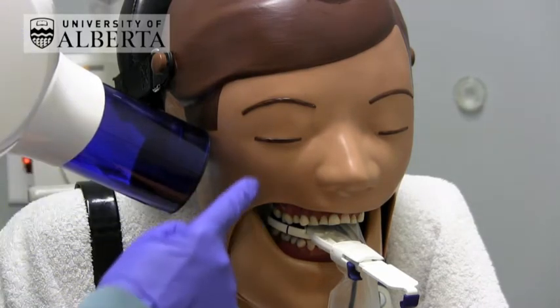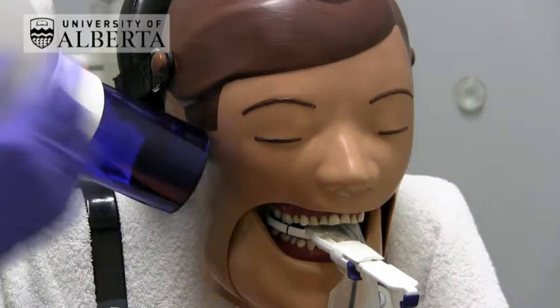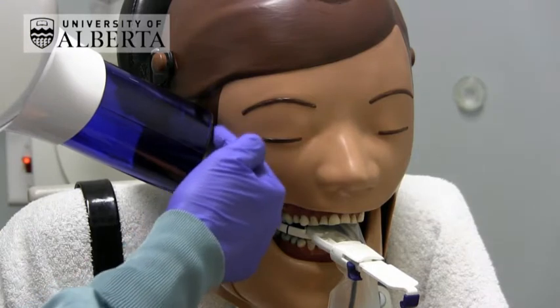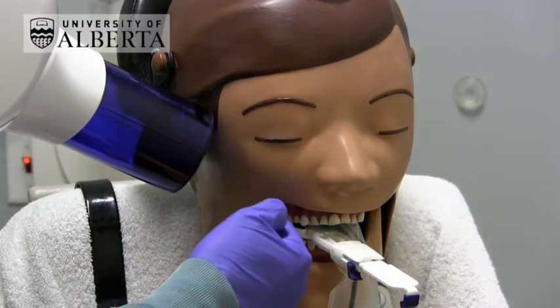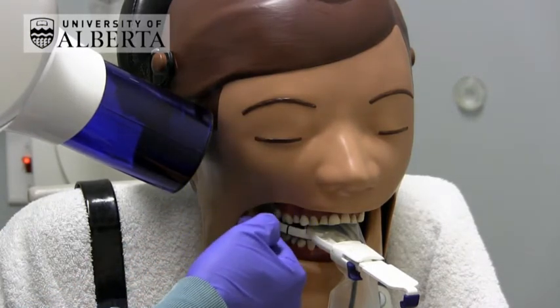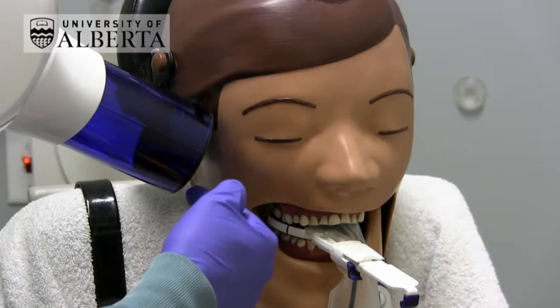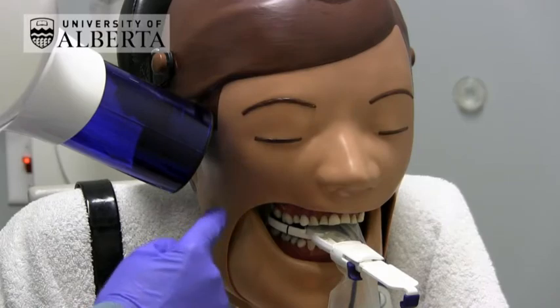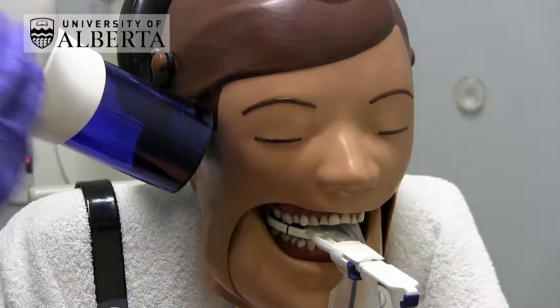Then you want to make sure that you are going to get the periapical areas of the teeth shown. I usually recommend about three quarters of the height of the BID being above the bite block and only a quarter of the BID being below the bite block. This is to ensure that you get the periapical area of the tooth and the crown of the tooth of interest showing.